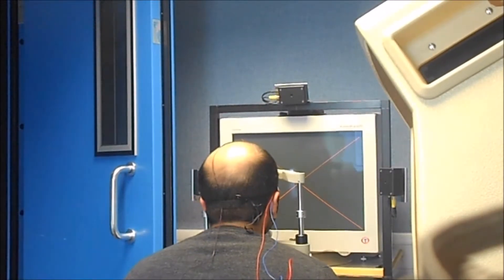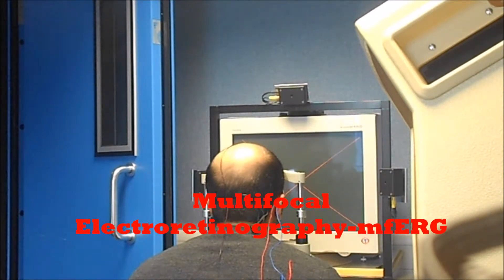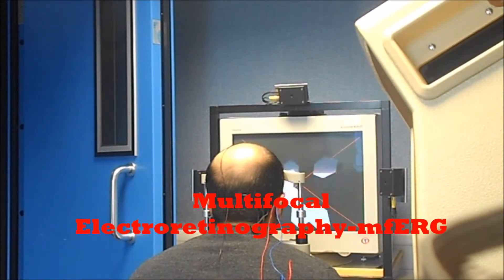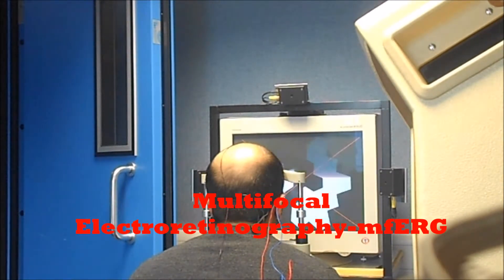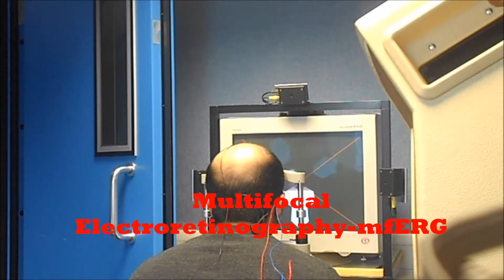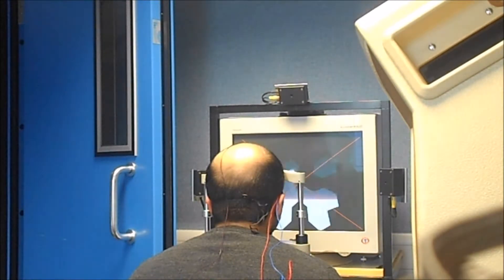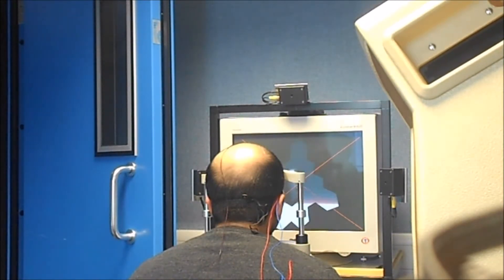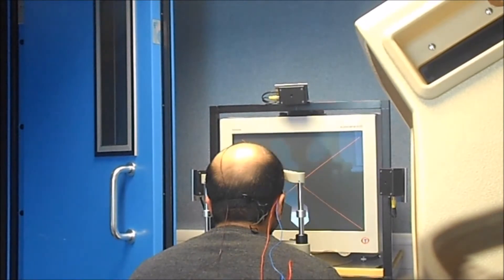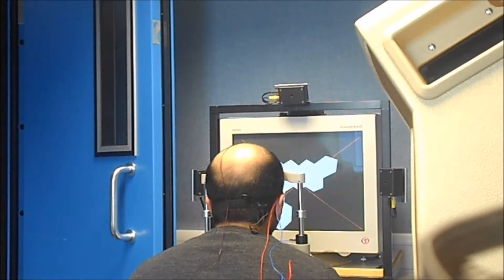Ready — let's just look straight ahead, nice and relaxed. The patient will be asked to focus at the center where those lines cross each other; that's where the patient has to focus. They can blink as normal, but not continuously.